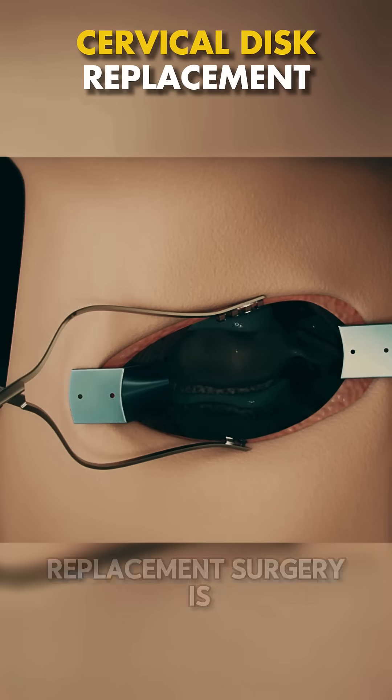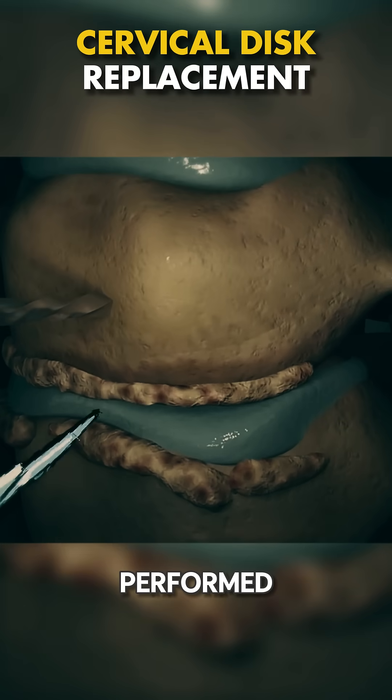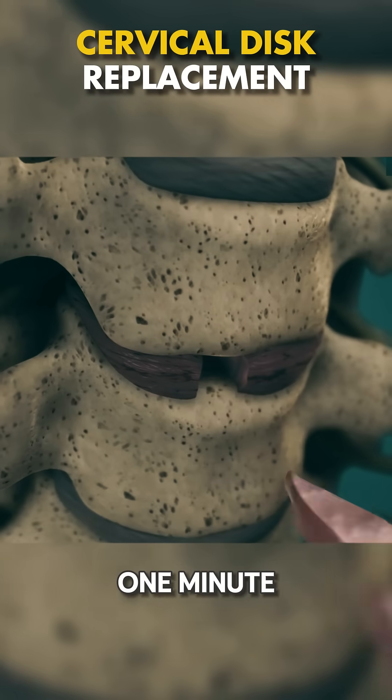Ever wondered how cervical disc replacement surgery is performed? Let's break it down in just one minute.